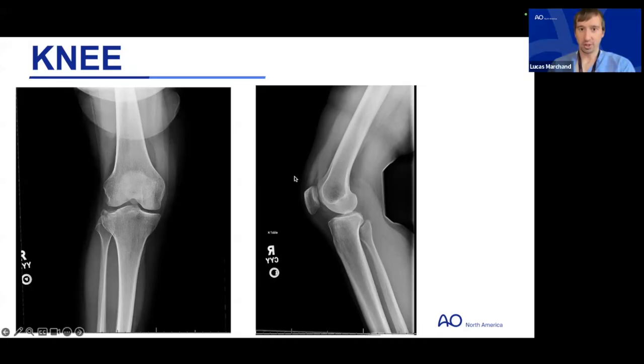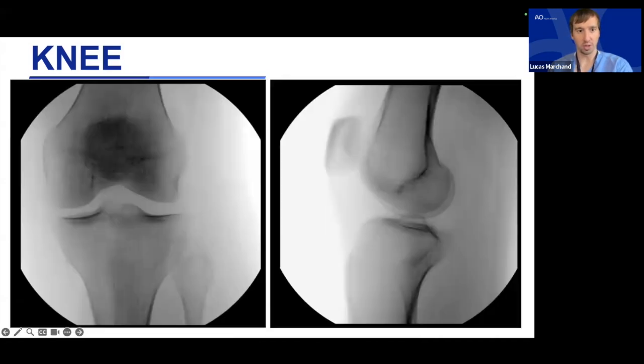Yeah, so Lily did a great job of highlighting the fact that this person's got a lipohemarthrosis, which is evident on the lateral radiographic projection. And she caught that because she went through her skeletal anatomy and then was looking at the soft tissue shadows and picked up on that. So excellent job, and thank you for pointing that out.